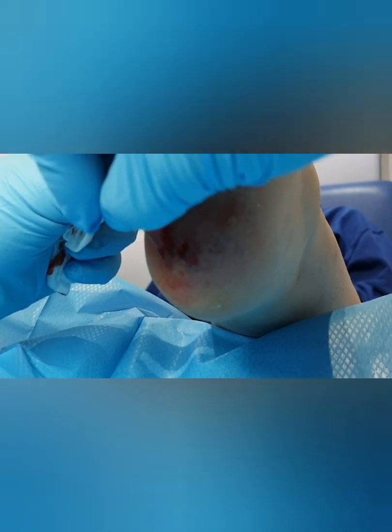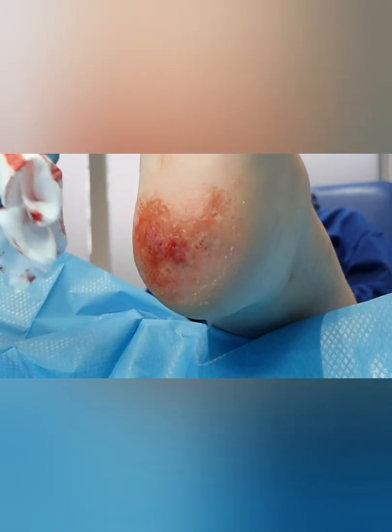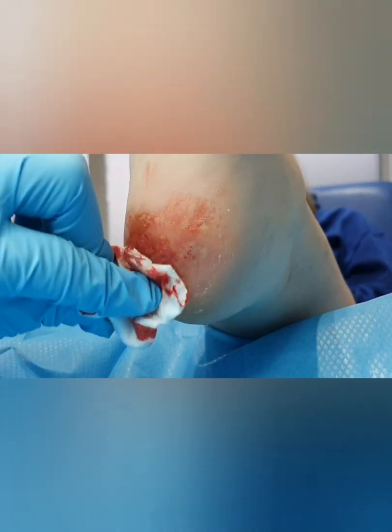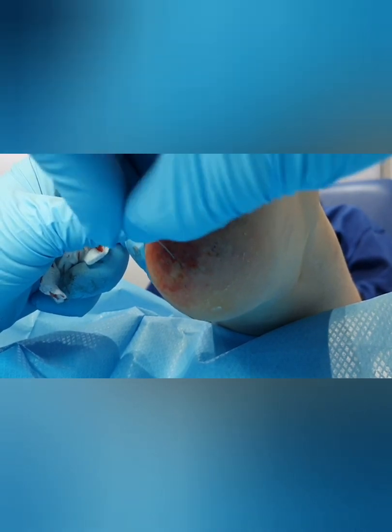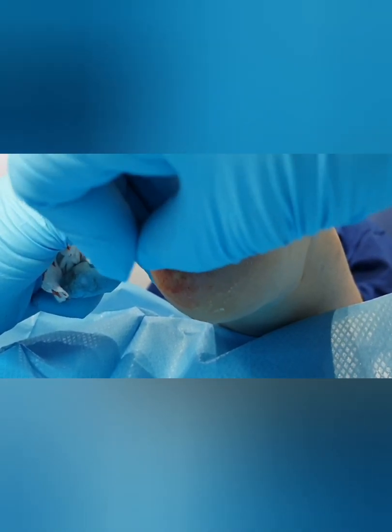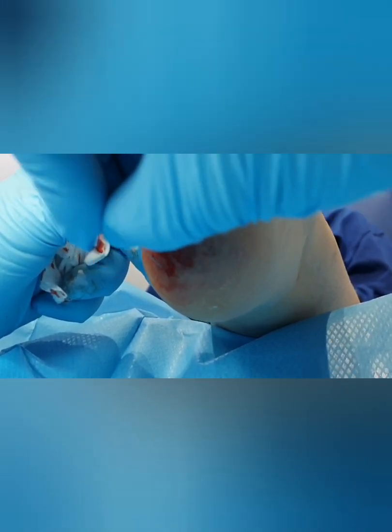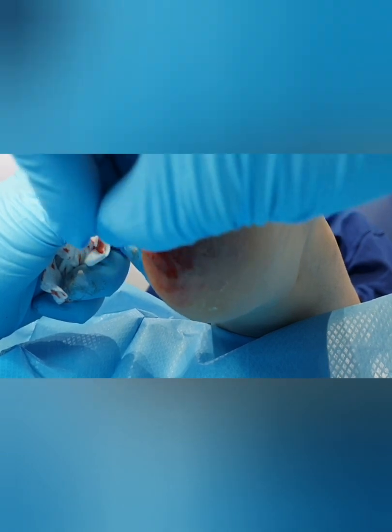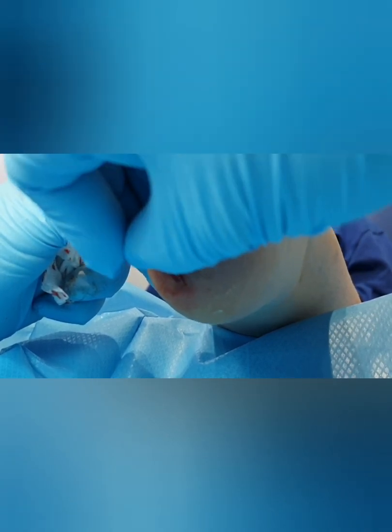The idea with the needling is by passing the needle through areas where these virus cells are living, we're stripping away this enzyme overcoat, and we're injecting these tiny little amounts of virus into the lower bloodstream, into the dermal area, and where the bigger, beefier immune system lies. Now, whereas before the immune system's kind of gone, well, I know you're there, but you're not really causing me any problems, so I'll leave you alone. Now it's like an invasion.